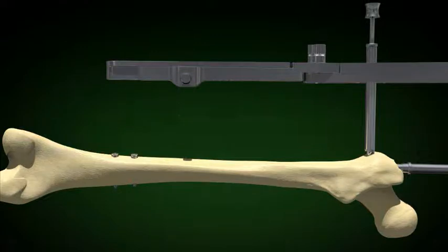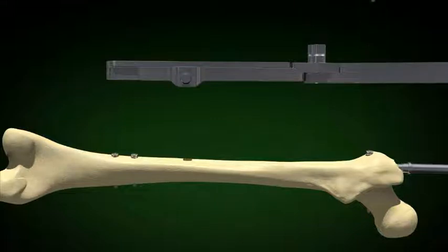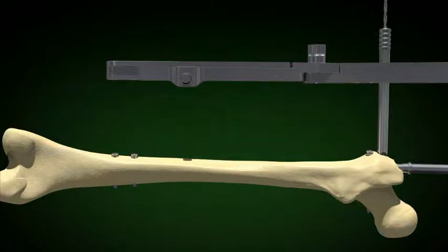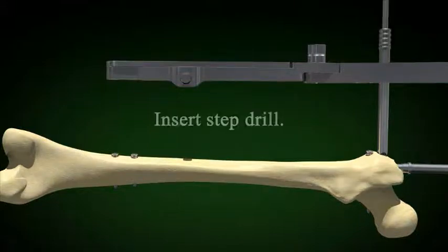Raise the cannula to see the screw proceeding, because the bone is thinner in the greater trochanter than in the diaphysis. Consider where the end of your drill bit is so you do not penetrate the acetabulum. Insert the step drill to enlarge the hole and place the proximal screw.